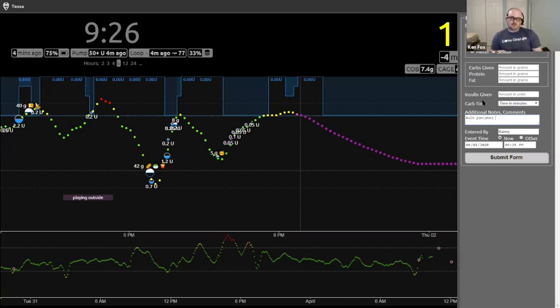I could probably be motivated enough to do just that one, where we could add, like, if you have a Nightscout URL entered into your Loop settings, it'd be great if on the carb entry screen it added like a notes option. So when you save it, it would go into Nightscout and you could log what food you were eating, and not like the emojis are not helpful. They're visual for 48 hours, but they're not helpful for looking anything up. So I find them more frustrating than cute, you know. So there you go. That's my insight into how I feel about carb entries.